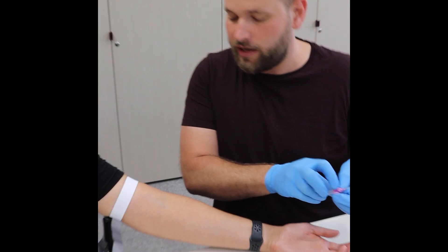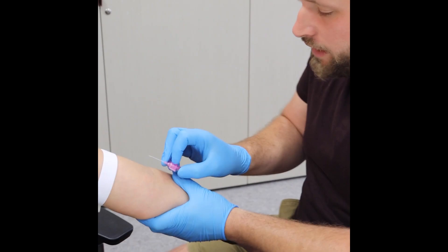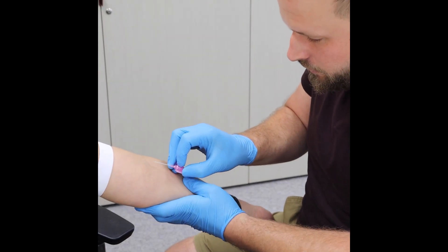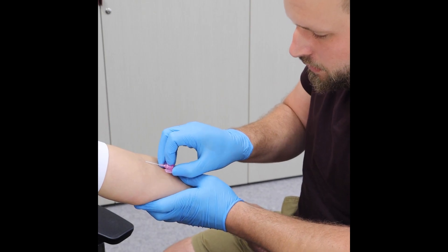I'm going to take her arm down like this, move tension, come in, done.